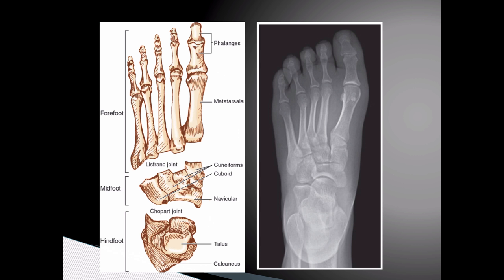Here we have an anterior to posterior view of the left foot. The foot is divided into the forefoot, midfoot, and hindfoot. The forefoot is made up of the metatarsal bones and the phalanges. The midfoot is made up of the navicular bone, the cuboid bone, and the three cuneiform bones. The hindfoot is made up of the talus and the calcaneus.